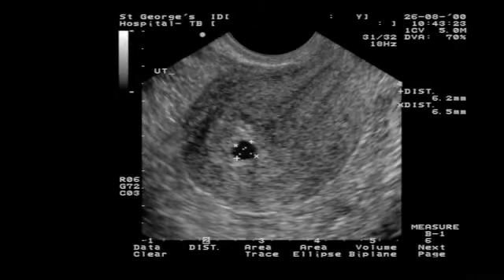So starting with normal findings, characterising the normal ultrasound features on scan. Depending on whether you're using a transvaginal probe or a transabdominal probe, obviously a transvaginal probe will give you greater resolution and enable you to see the early pregnancy much earlier. We first see a gestation sac at 4 to 4.6 weeks of gestation. That is accurately dated from the first day of the last menstrual period, corresponding to 32 to 34 days. At this stage, the gestation sac is 2 to 4 millimeters in size.